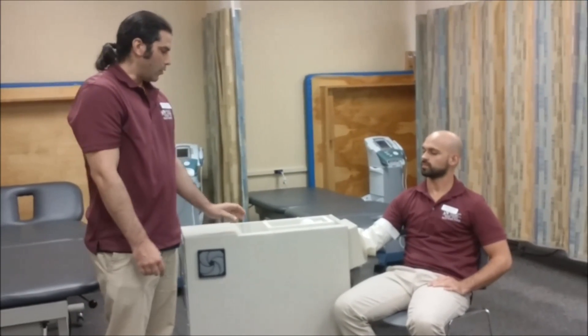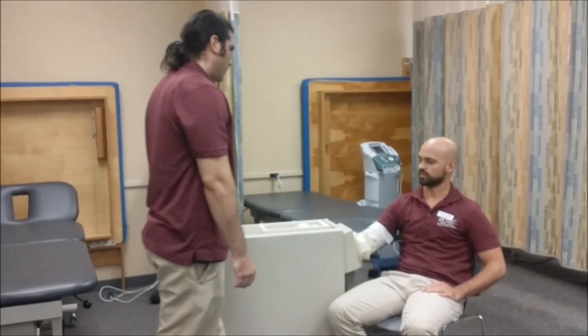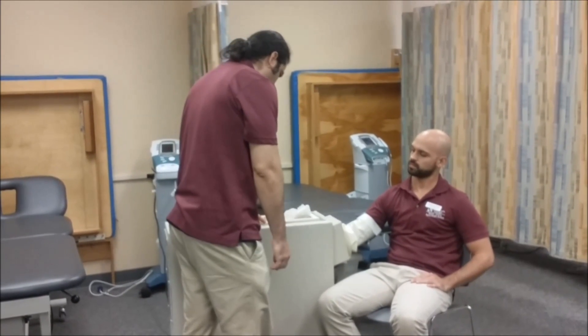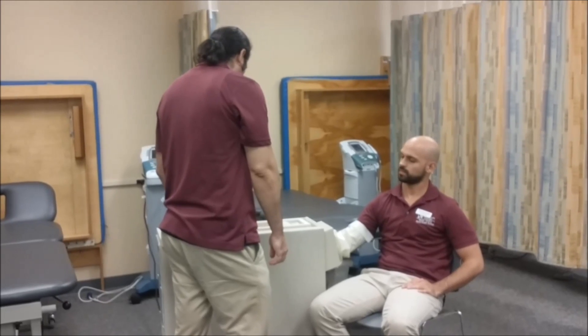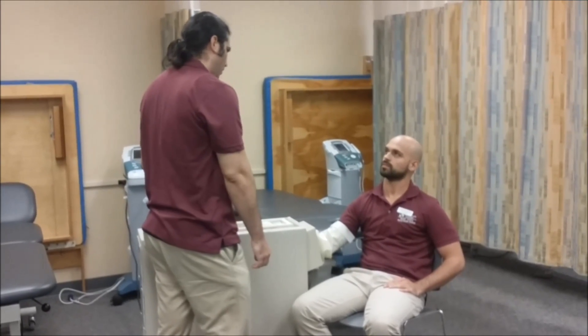Five minutes have passed. I'm going to reassess. How are you doing? Let me see the hand. Everything looks fine. If at any moment it's too hot, let me know.